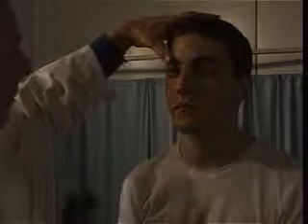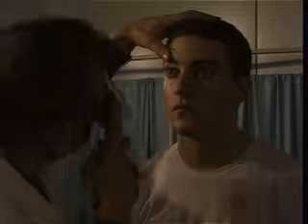It is recommended that when you examine the patient's right eye, you hold the ophthalmoscope with your right hand, look with your right eye, and vice versa. This allows you to get as close to the patient as needed, because both your nose and the patient's nose are not in the way. The closer you get to the patient, the better, as the closer you are, the wider your field of vision will be, just like looking through a keyhole. It is advisable to keep your other eye open during the examination.